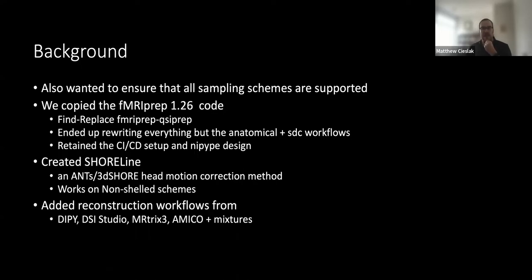But the reconstruction workflows, in addition to being able to do custom things, also have the most vanilla, not incorrect versions of published pipelines, so that if you read a paper and say, I want to reproduce this reconstruction workflow, we have a list of them that are supported, that we've consulted with the developers of the original pipelines, and we know that the necessary steps are in there.